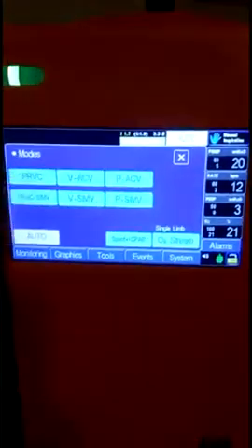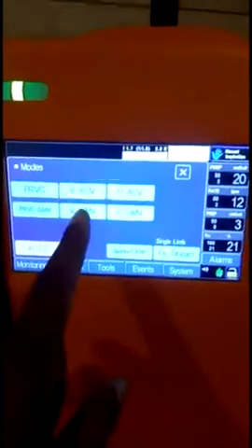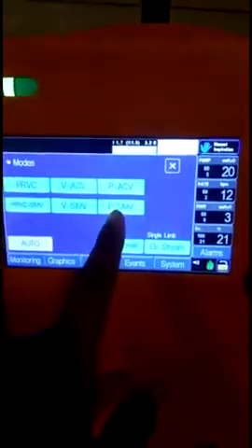The ventilator has now been turned on. It will perform a self-test, and then you will get the user interface standby screen.